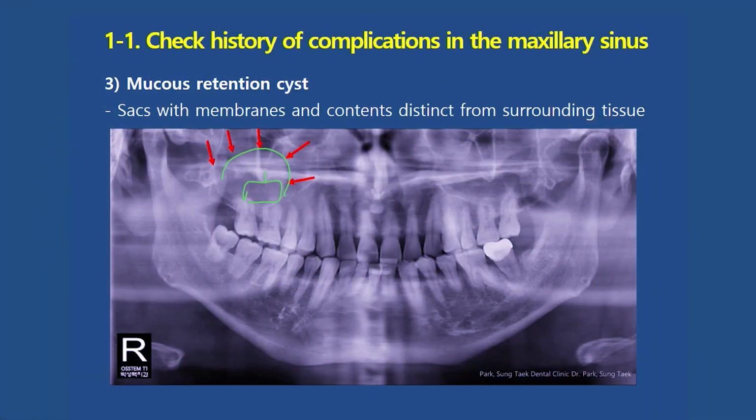If that is too stressful, you can use a 50cc syringe with a thick needle to aspirate the contents inside. If the size is small and if all measures that have been discussed come off as too much for you, then you can do sinus lift cautiously and proceed with surgery in the traditional way.